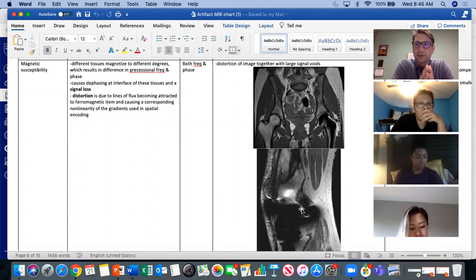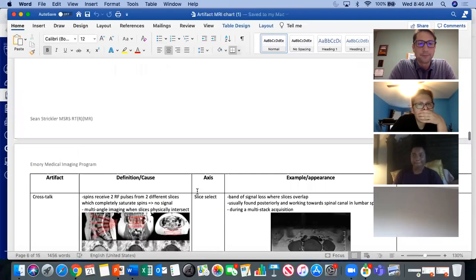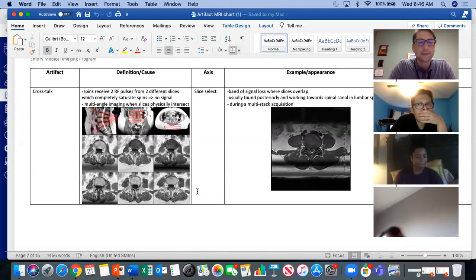Sometimes the best option is not to bring them out quickly, but to bring them out slowly so it doesn't rotate or torque that aneurysm clip. We talked about that in our safety lecture back at the beginning of this class. All right, so we got to about right here.